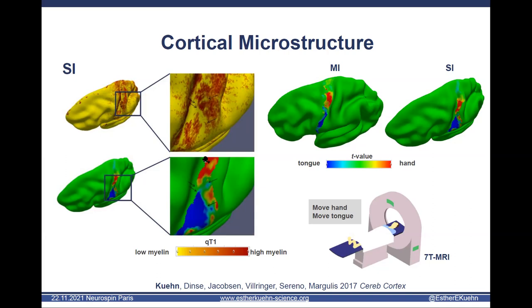I don't have the data here now, but we validated this using different measures. We looked at the HCP data, with 500 participants. We also looked at resting state, and saw resting state correspondence, so we can talk about it later. I'm just showing you two single subjects here to show how the smallest unit looks, but you could validate it with different measures.